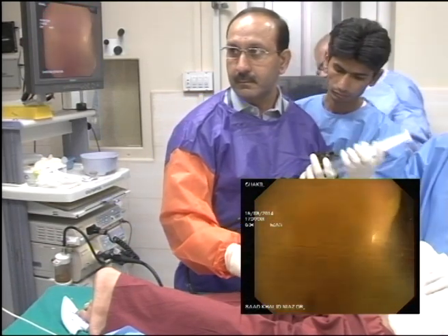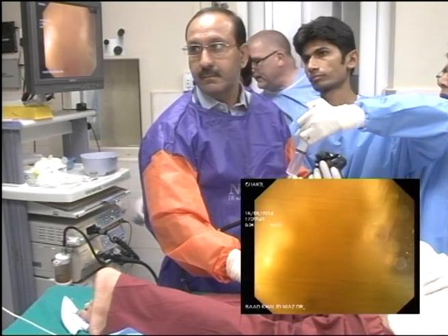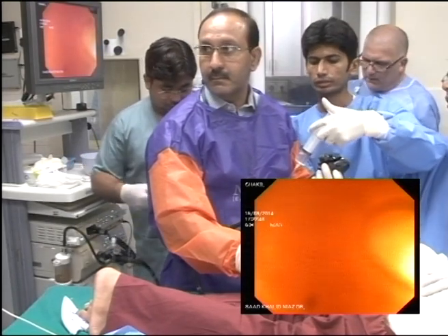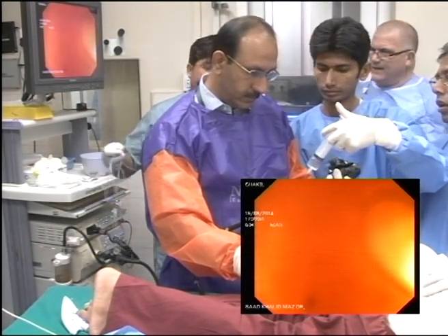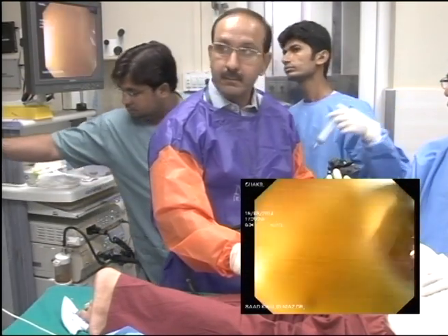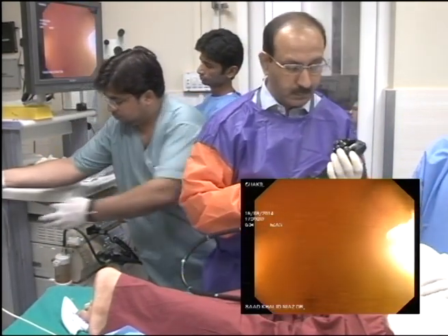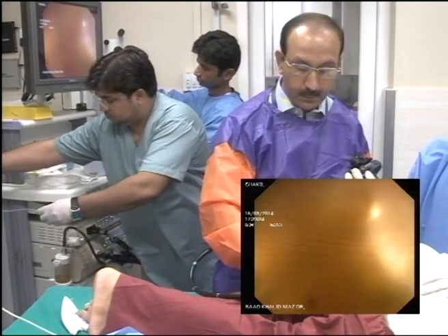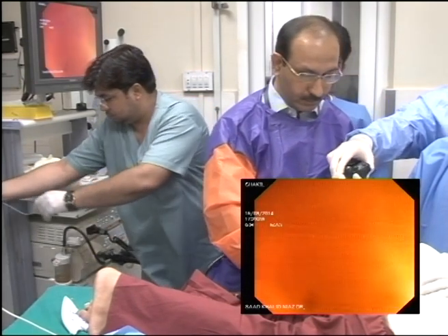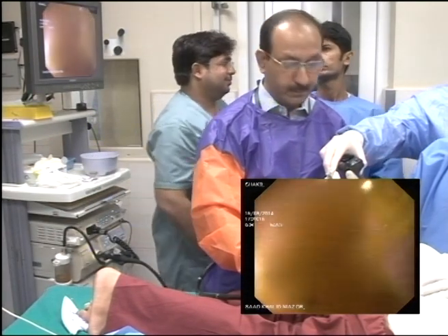An innovative use of a drinks bottle. Well done. What was that? I'm just looking at your large drinks bottle. I think it's great. In the UK, they wouldn't use that at all. We're not allowed to use anything that isn't sterile, and we're putting stuff into a non-sterile area, and yet we have to use sterile water. And you also started to put in the fecal transplant. So how do they make that sterile? I haven't got a clue, my friend. They invent all sorts of bloody stupidity.